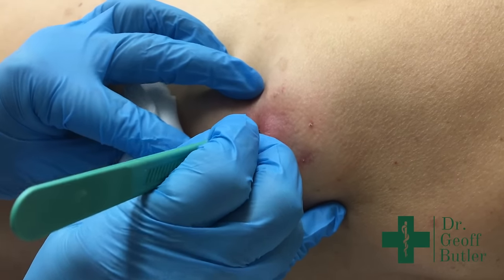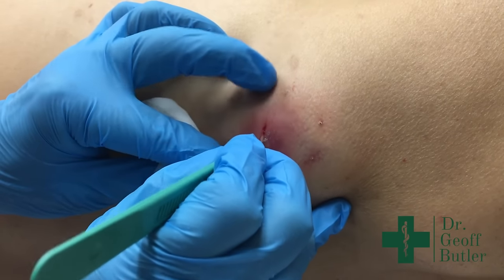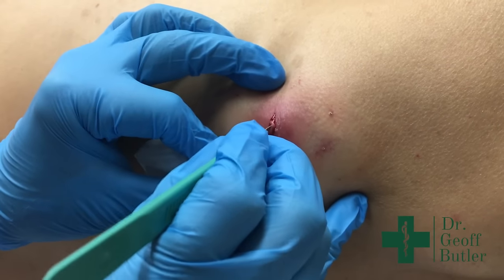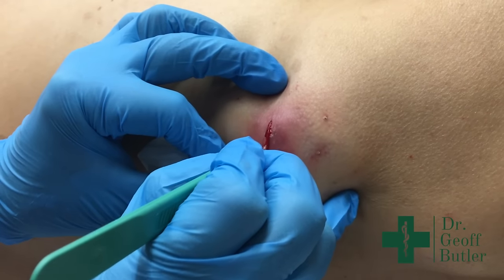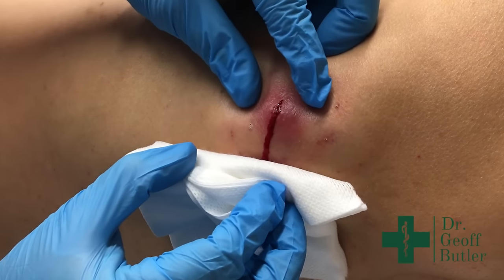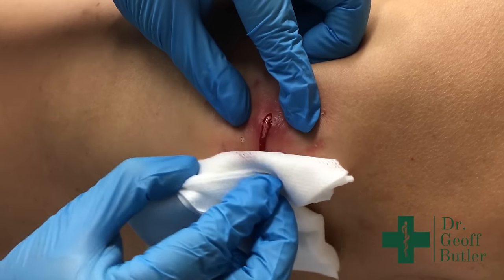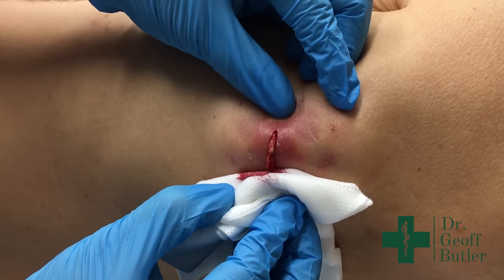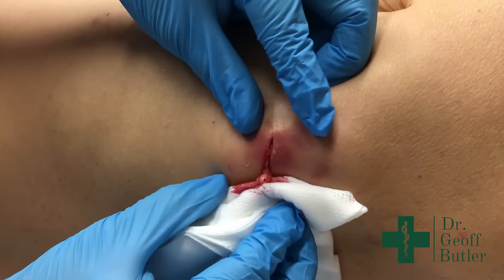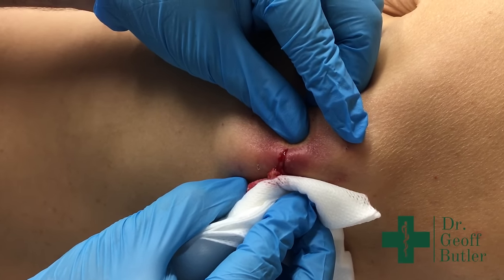And the issue here is: is this all abscess, or is there a cyst underlying it? So you can see the purulent material is coming out — that's just white cells. But this seems a bit thicker. So this looks like an infected cyst more than just an abscess.